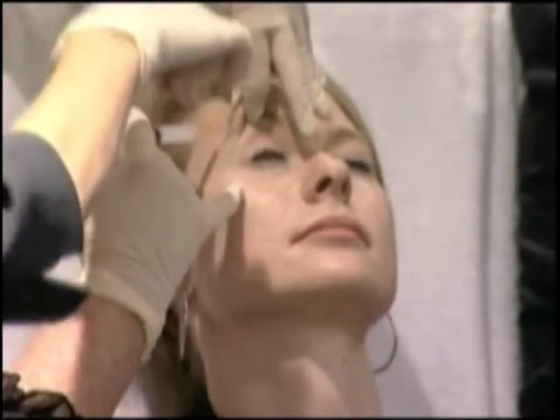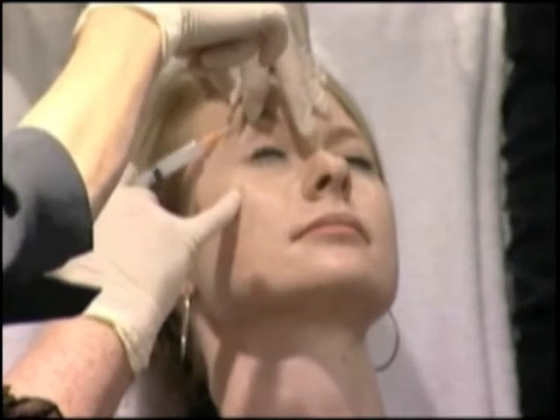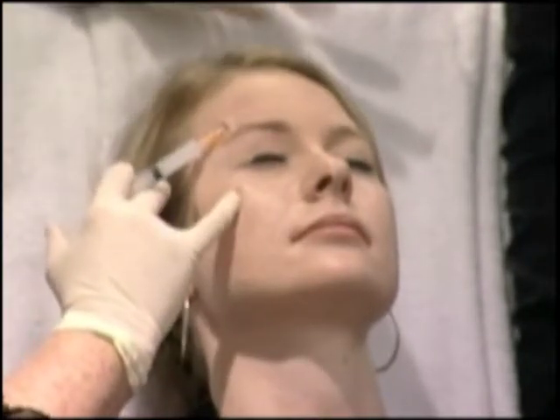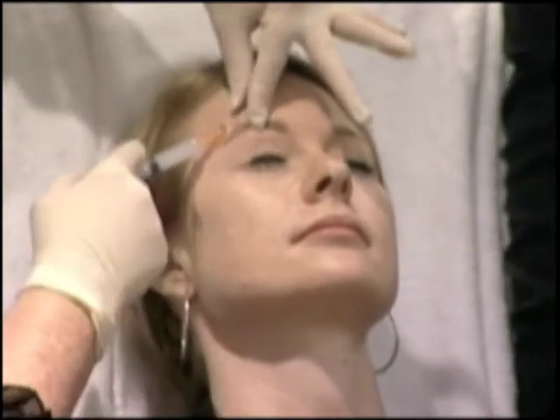So if you lift that really high, go all the way down to the bone, there you go. Now let go of this. Now try and lift that needle and it won't move. Do you see that? So you know you're in the right place.